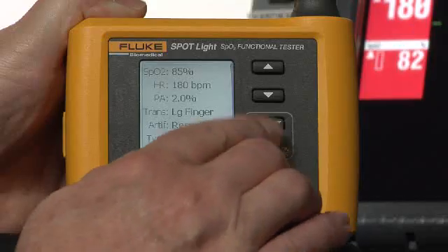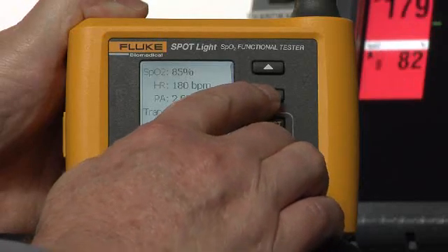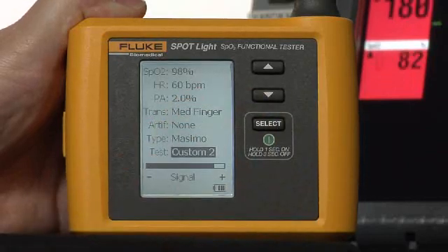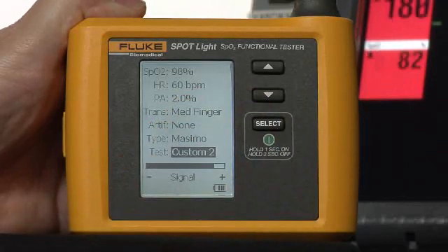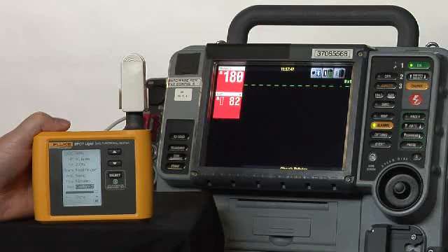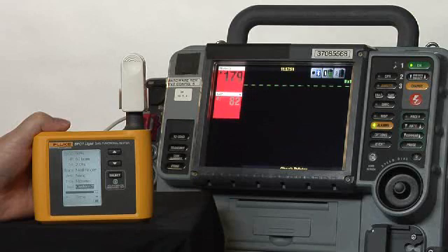Then we'll move to Custom 2, which is a normal patient. We want to let the alarms continue to sound, because the normal conditions will let them silence on their own, an important part of the functional test.